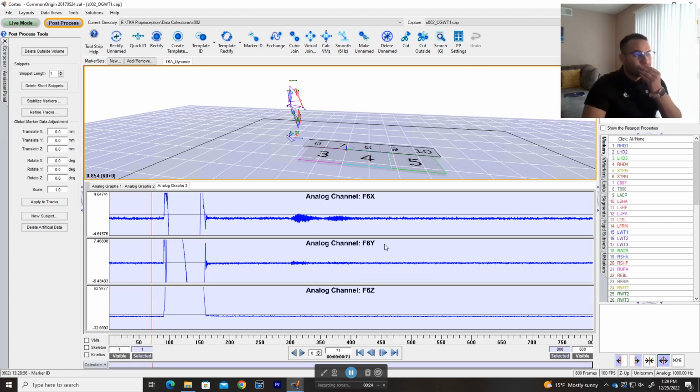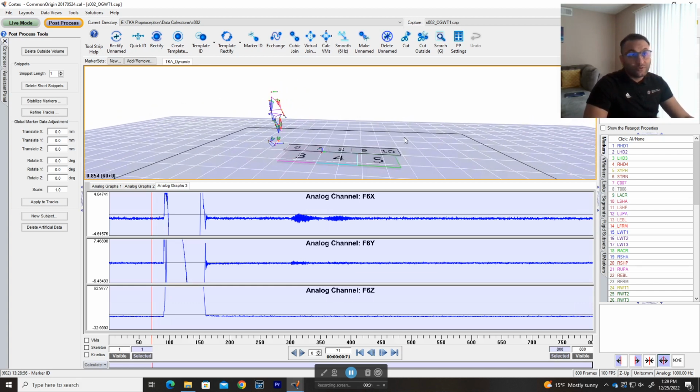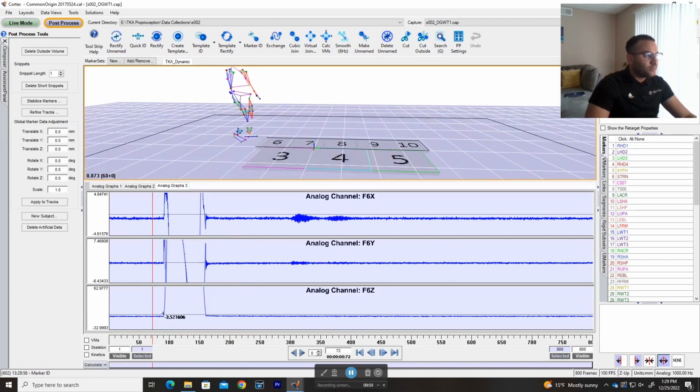So the first problem that you will probably face is when you forget to zero the force plates. As you can see here in this trial, some of the force plates were not zeroed. You can see here, instead of starting from 0 in force plate 6, this force plate right here, it starts below 0, so it was not zeroed properly.